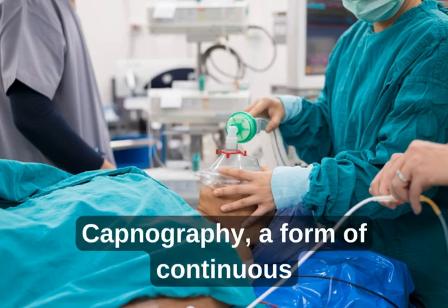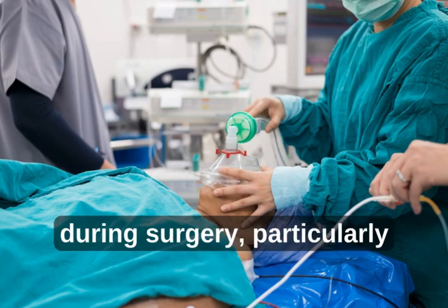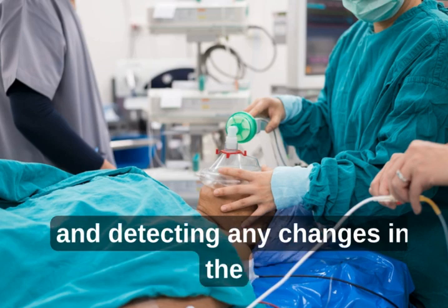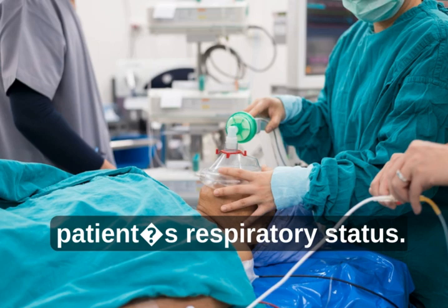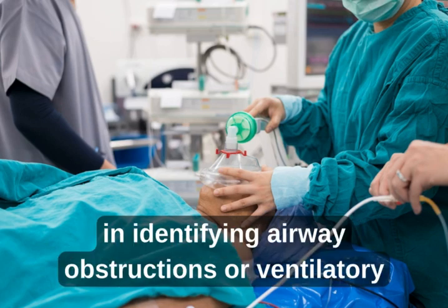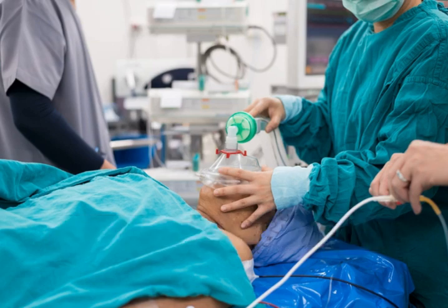Capnography, a form of continuous EtCO2 monitoring, is highly valuable during surgery, particularly in assessing the effectiveness of ventilation and detecting any changes in the patient's respiratory status. It is especially useful in identifying airway obstructions or ventilatory issues early in the procedure.